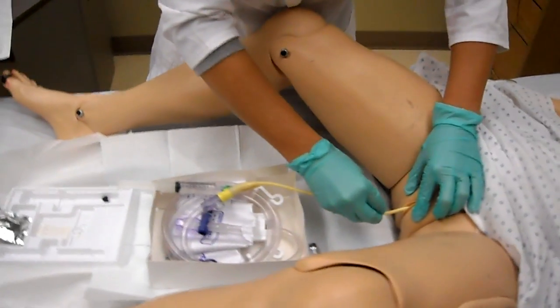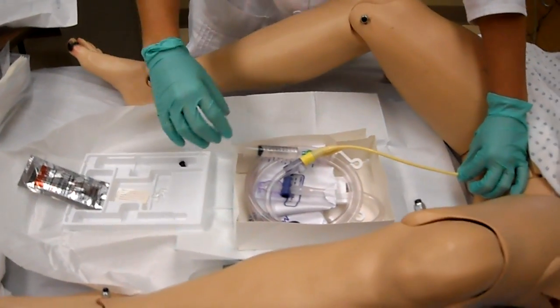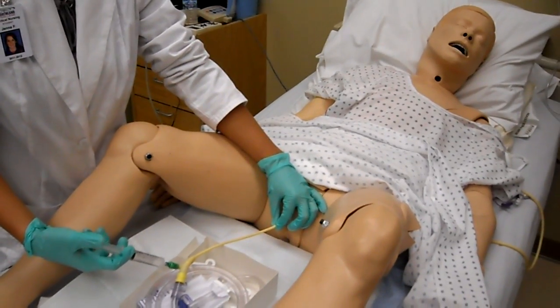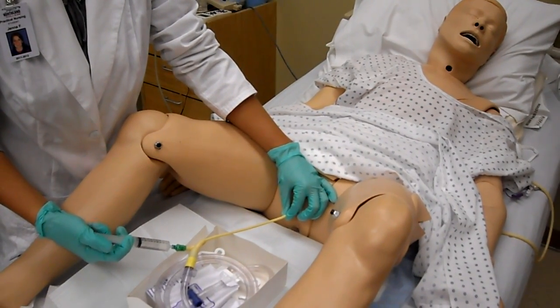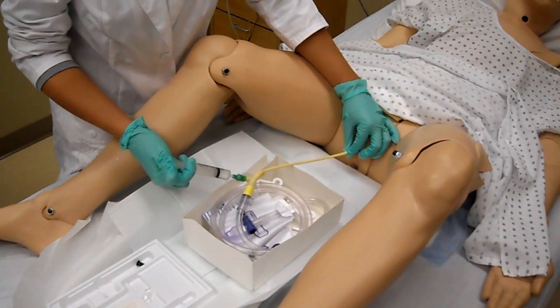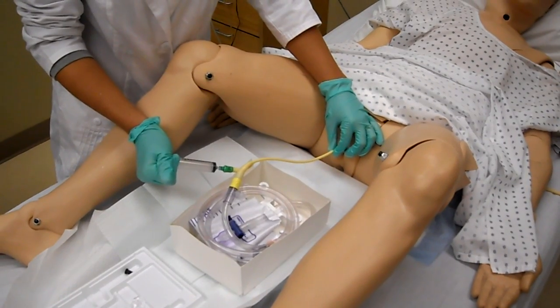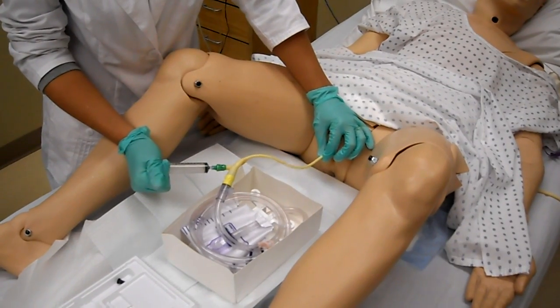Then you're going to switch hands, keeping your dominant hand sterile. You're going to insert the 10 cc's into the balloon, and as you're doing that, watch the patient's face for pain or grimacing. Maintain force on the syringe, then take this hand and tug slightly to make sure you get retention and confirm it's in the bladder.